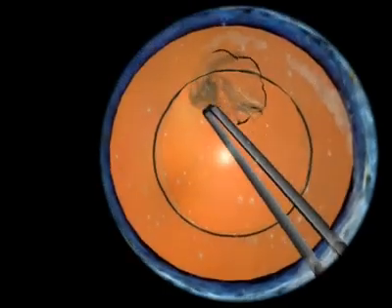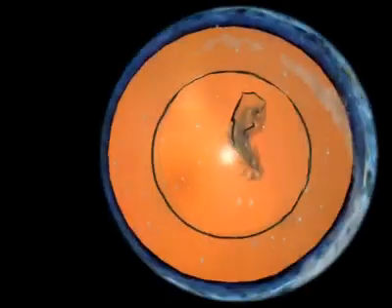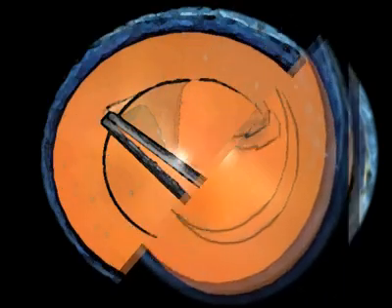At the conclusion of this simulation, the device will give you a score which tells you how well you stayed centered, how well you stayed along the line, and how much you touched the cornea, among other factors. I did fairly well on this, about an 89 or so out of 100.